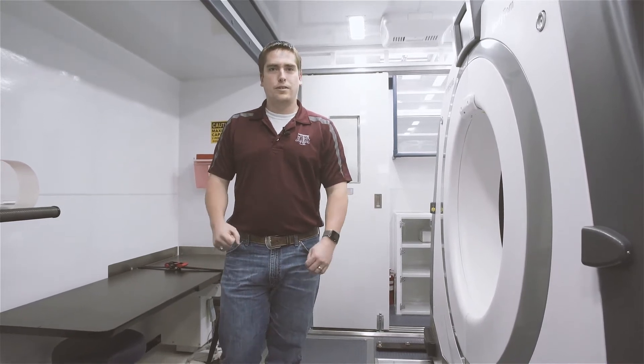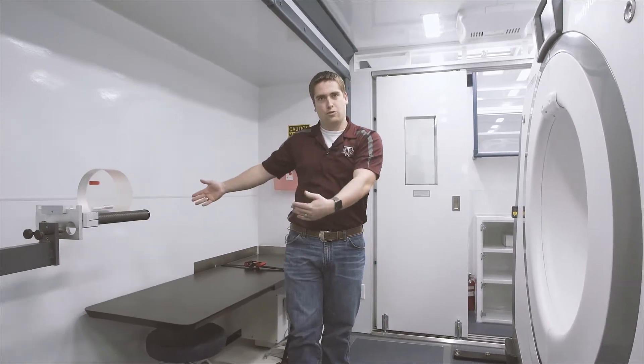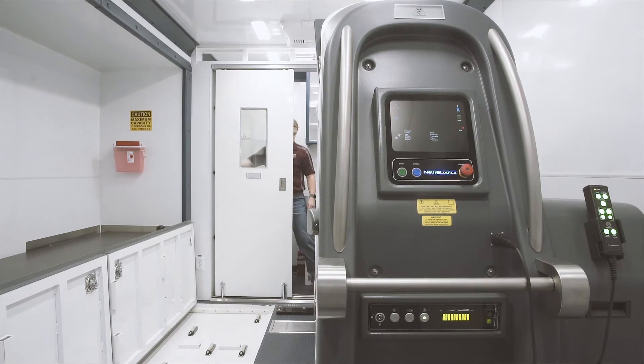The first thing you'll probably notice is this big cavity over here that provides a little bit of extra space. It's providing extra room for maneuvering the patient and for maneuvering the staff.